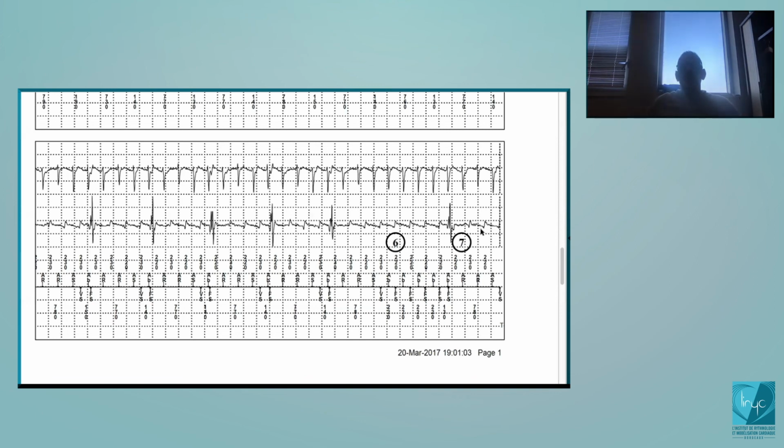Okay. So, in which situations do you encounter this kind of problem? Problem of P wave oversensing, or atrial activity oversensing? Could be that the lead is too close to the tricuspid annulus. Yes, that's the main reason. If you place the lead just after the tricuspid, then you may.